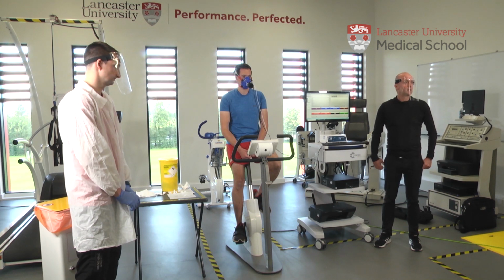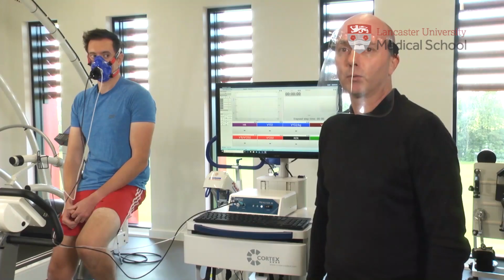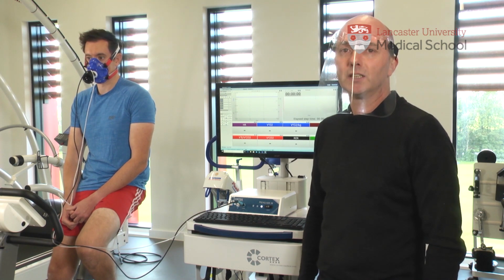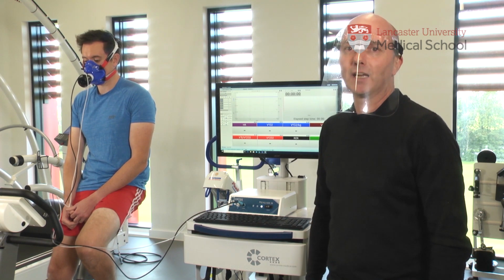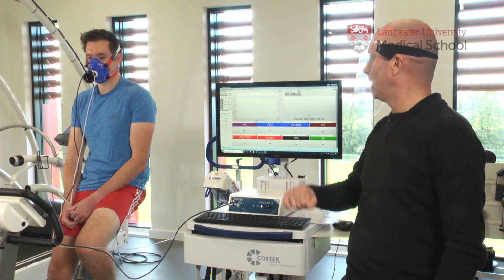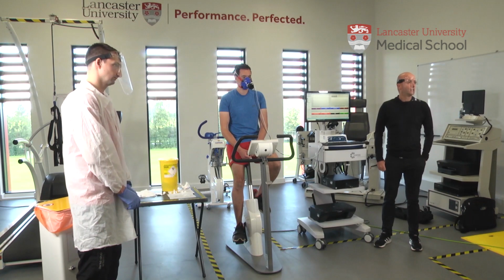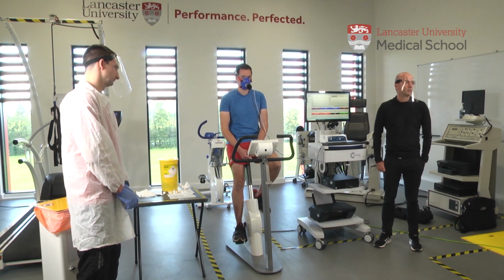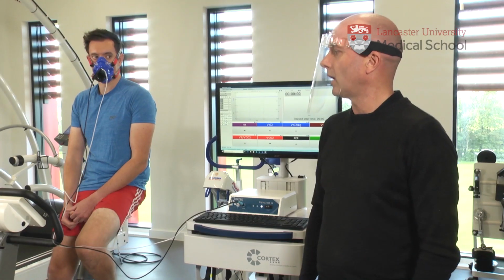So today's test will be around 40 minutes in duration. We're going to do 4-minute stages and we're going to take blood lactate every 4 minutes. We're also going to take the gas analysis so we can start to work out ventilatory thresholds as well as lactate thresholds. And so we are getting ready to start.